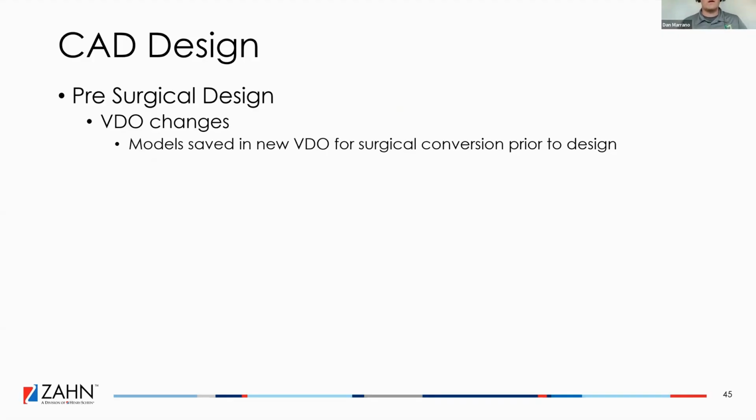Now this is where I am still primarily in 3Shape world. We use exocad to support our needs in 3Shape. We very much like this. We've always kind of been with 3Shape for a long time now.